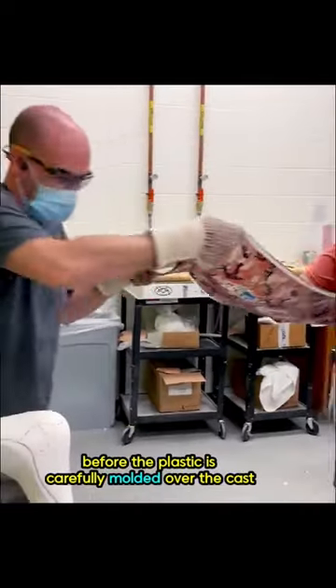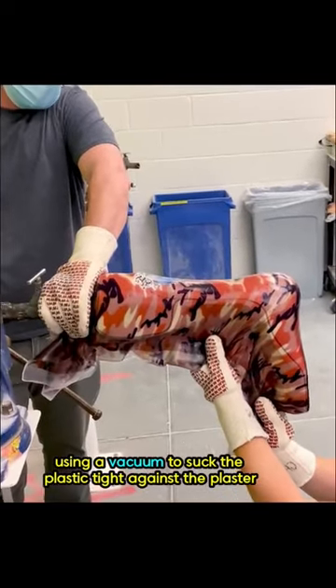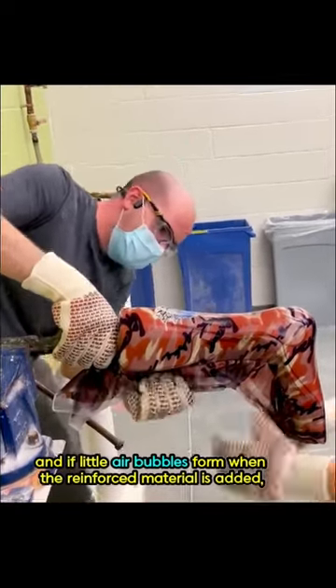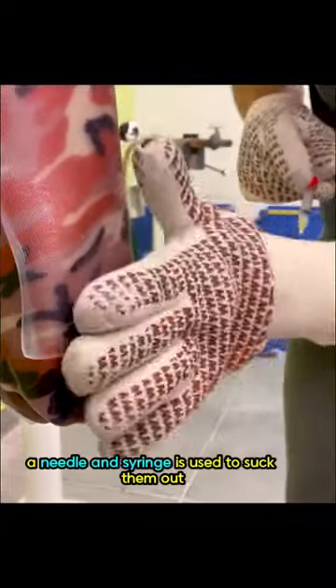The plastic is carefully molded over the cast, using a vacuum to suck the plastic tight against the plaster. And if little air bubbles form when the reinforced material is added, a needle and syringe is used to suck them out.